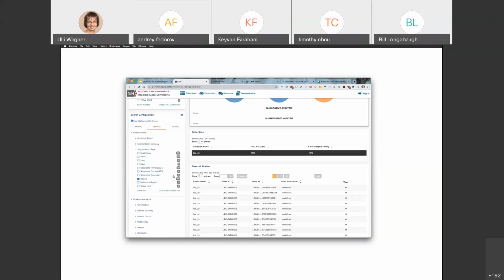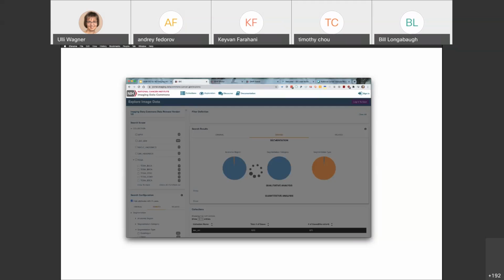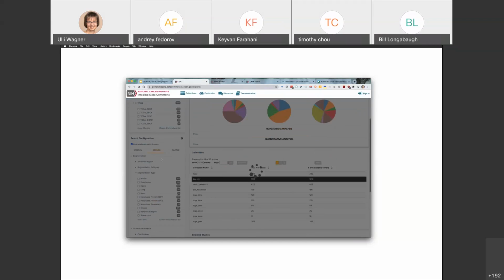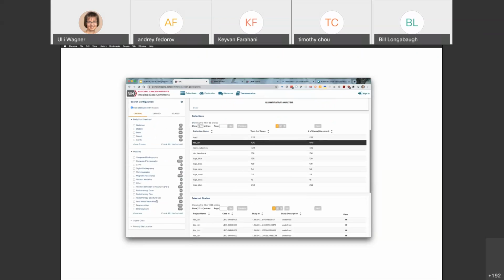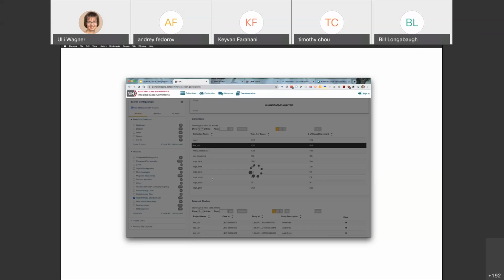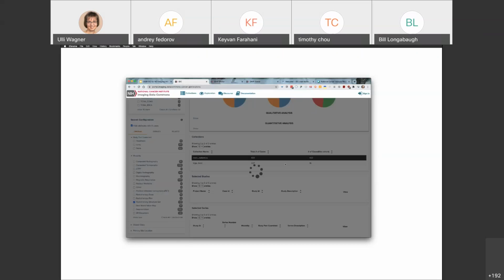At this time, we support 2 types of annotations. It's the DICOM segmentation object, but also the radiotherapy structure set. So if I can show you another example, if I go to the original tab and select radiotherapy structure set cases, you will see here there are 2 collections right now that have this type of data.